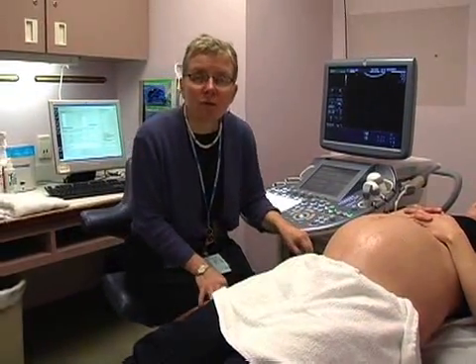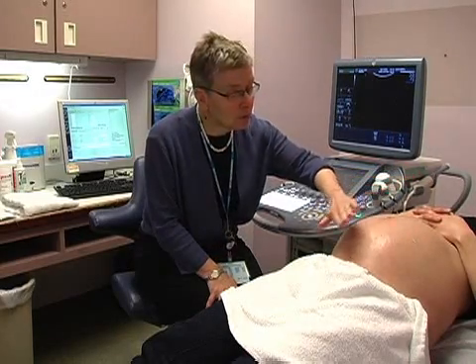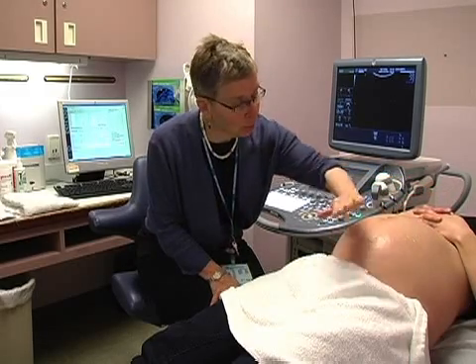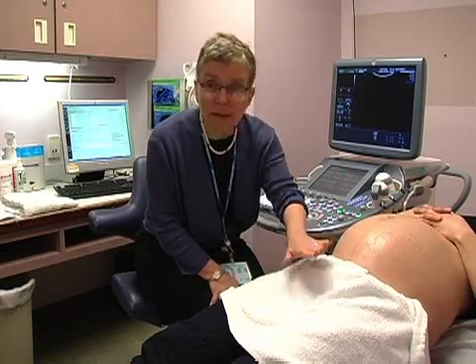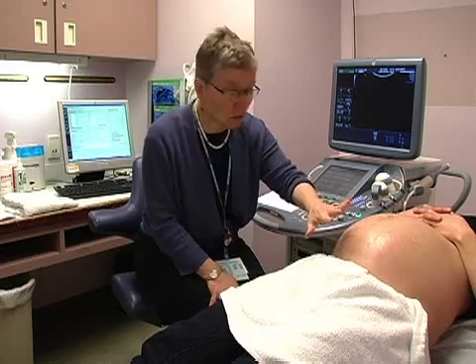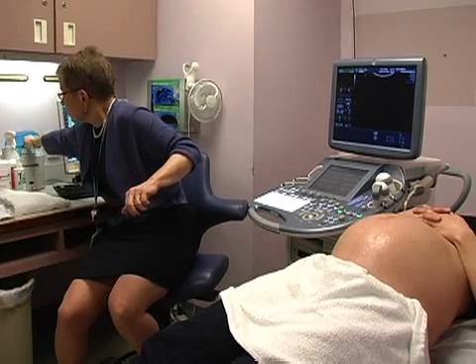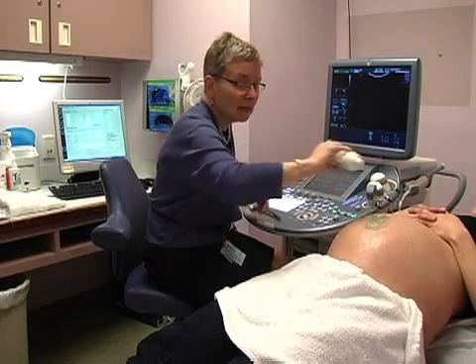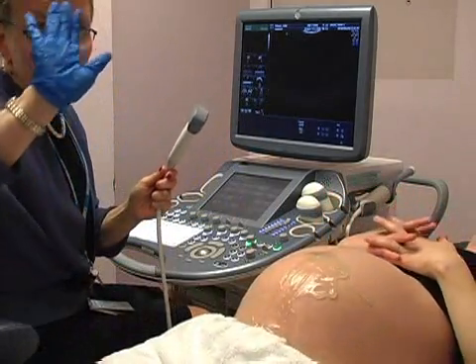This is Ms. Jones, and Ms. Jones is in her third trimester with twins. I'm going to show you how we expose the abdomen. We leave her covered at the top, and before we pull her top up or her pants down, we place a towel over her abdomen. This helps ensure her privacy and also makes sure that the gel on the abdomen doesn't go all over her clothing. We keep our gel in the warmer and put it on the middle of the abdomen — if you put it on the sides it's going to squirt all over the place. Remember to wear a glove when scanning.